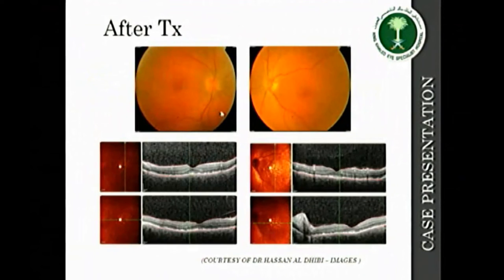And this is the image and the OCT after treatment. We can notice there is no disc edema, and in the OCT the retina and choroid have returned to a normal picture.